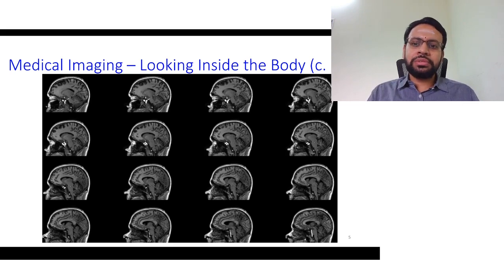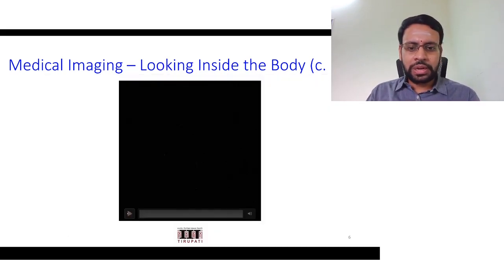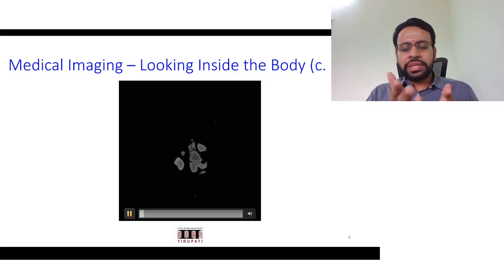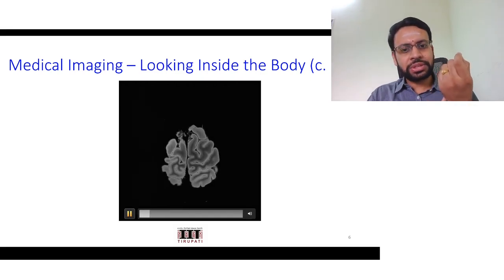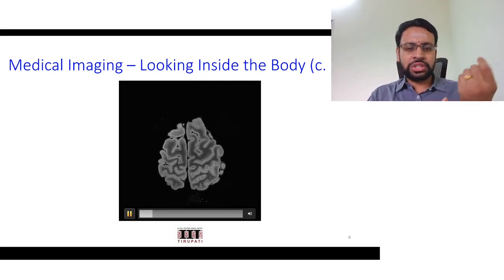Say, for example, this is a magnetic resonance image, also known as MR imaging, and let me play a video of it meanwhile while discussing that. So this is, I guess, done at 100 microns level. You could get this precision using MR imaging, which is non-invasive.